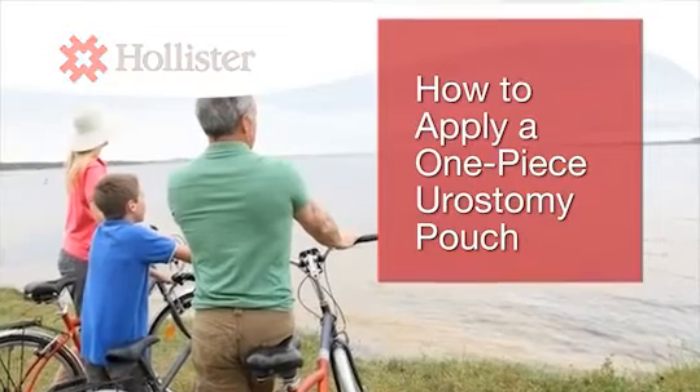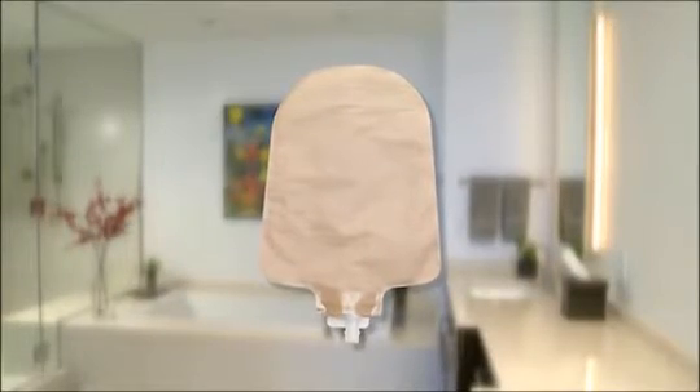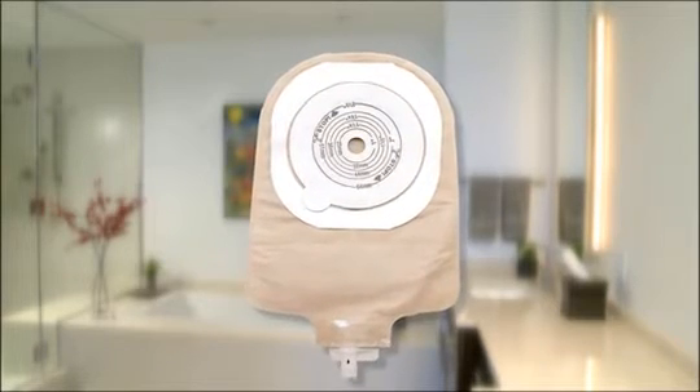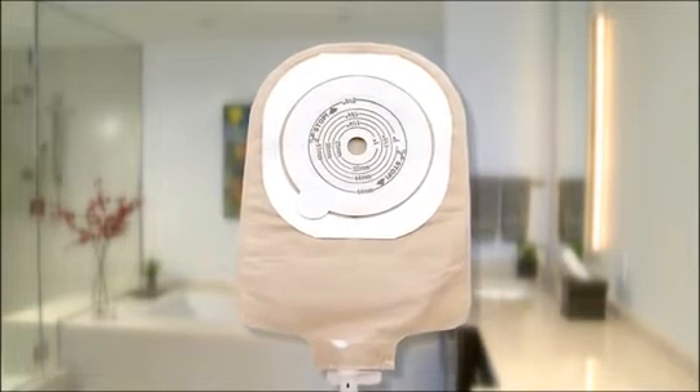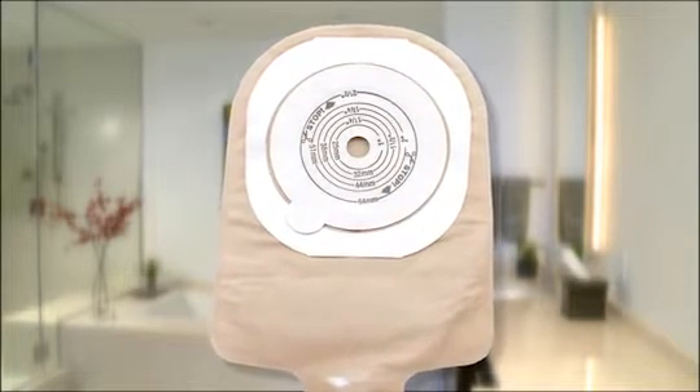Finding the right pouching system that works for you and learning how to use it correctly is important. Because the pouch and skin barrier of a one-piece system are applied and removed together, a one-piece pouching system can be very easy to use.